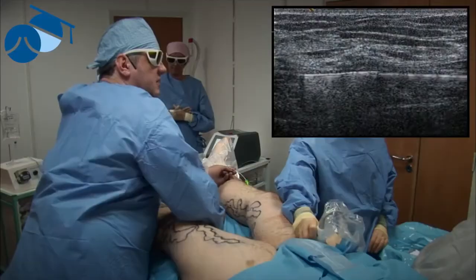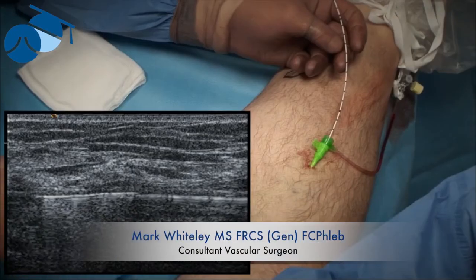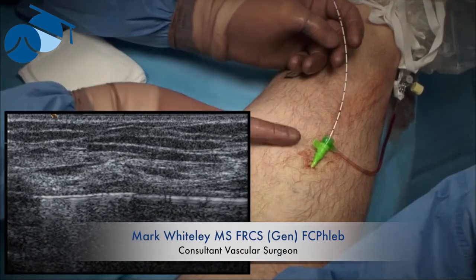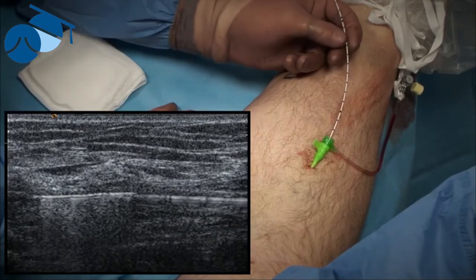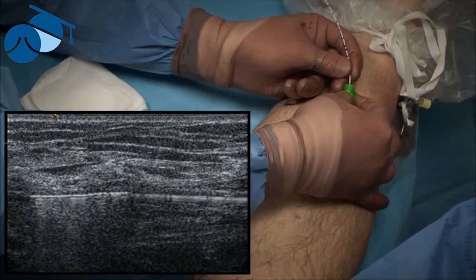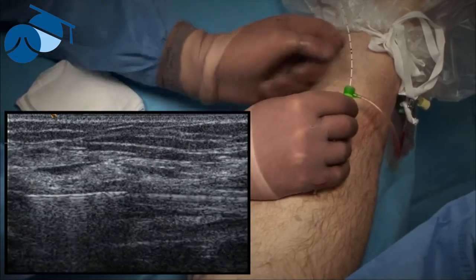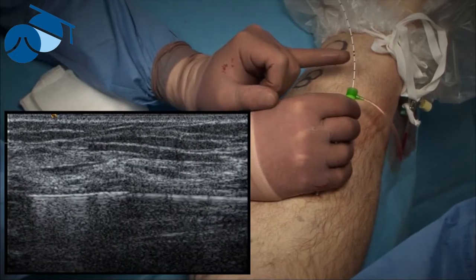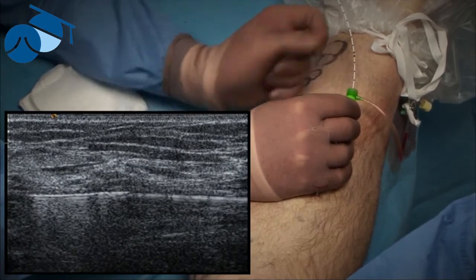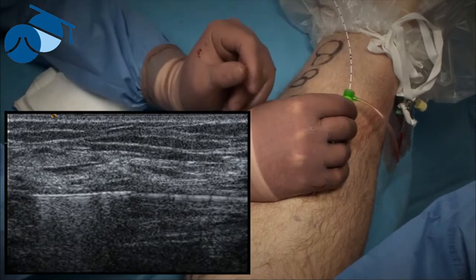The endovenous laser is now at the saphenofemoral junction, and we keep an eye on that with the ultrasound. With this system we have quite a long introducer sheath, so holding the laser fibre exactly where it is, I withdraw the sheath back so there's only about 2 centimetres left inside. And what I always look at here, we've got 2 sections here, 1, 2, 3, 4, so it's 4 centimetres back from the 2 mark, and that's going to allow me to calculate the length at the end.